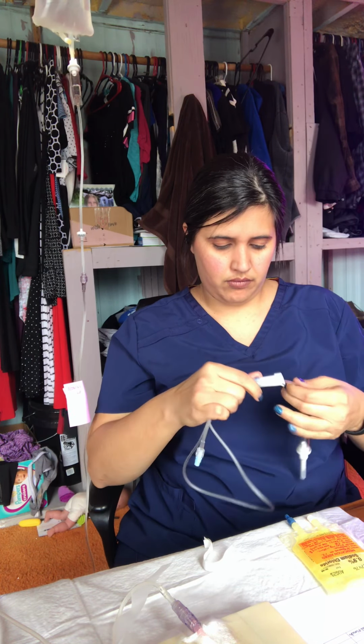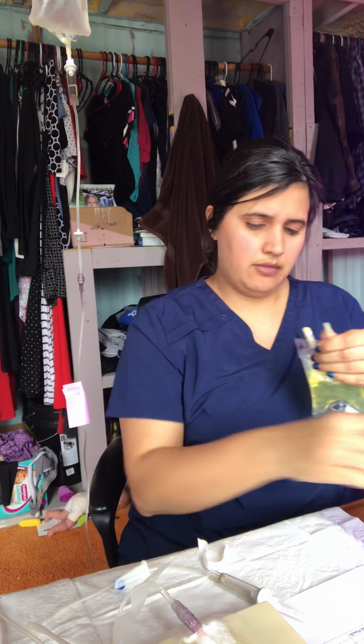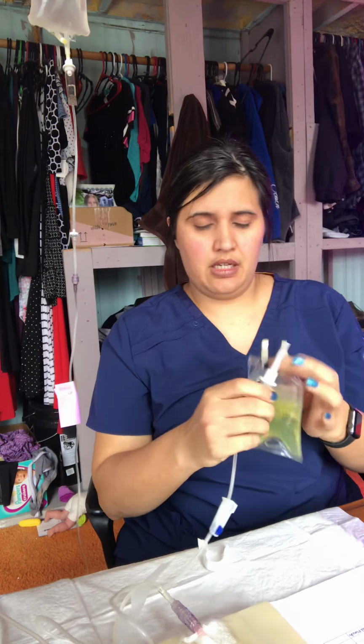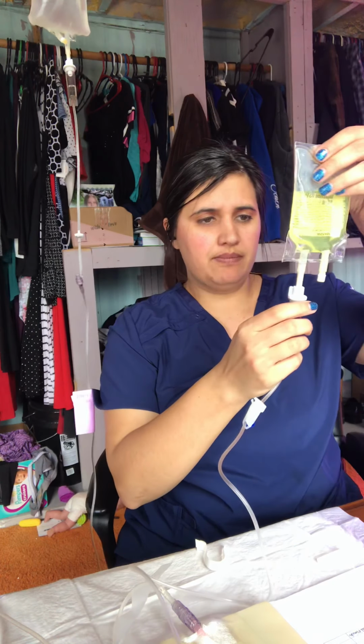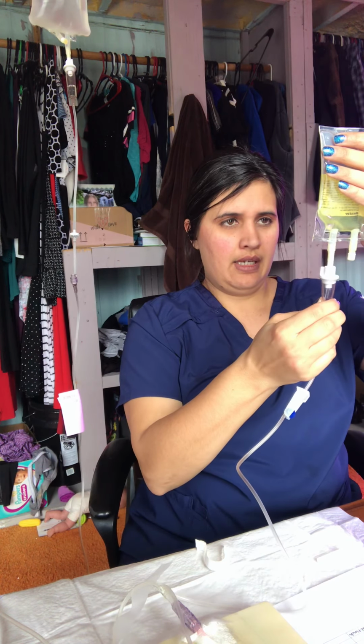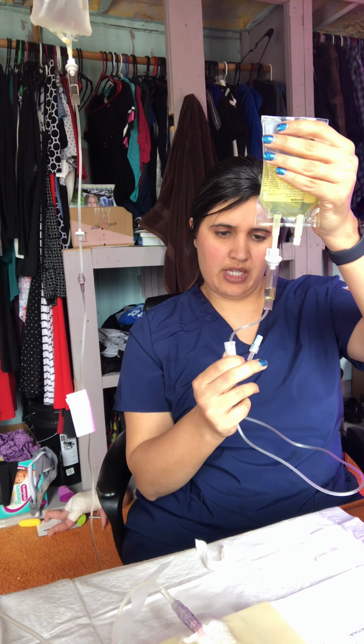All right. So I'm going to take this blue top off, and I'm going to stick the bag. All right. I'm going to flip it and fill this drip chamber so I can see some drops. There we go. Now I also want to prime this tube without losing medication.